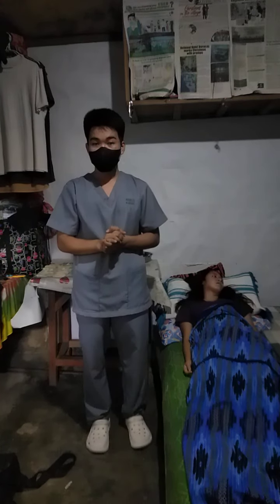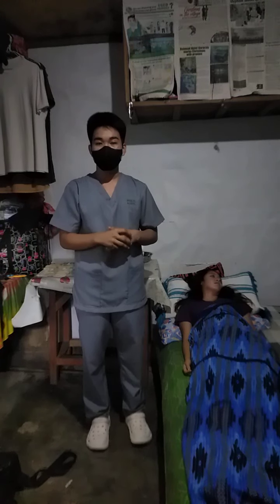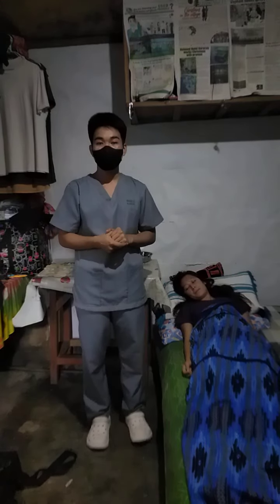Drape the chest with a bath towel or disposable pad. Have an emesis basin and tissues handy because passage of the tube may stimulate gagging and tearing of eyes. So, ma'am, maglalagay lang po tayo ng towel. Then after that, put on gloves.